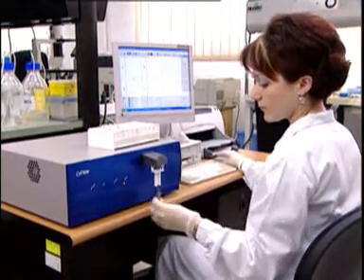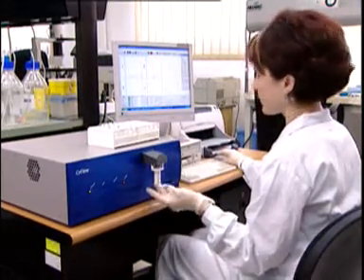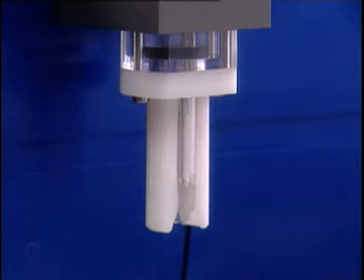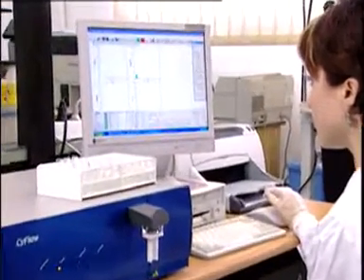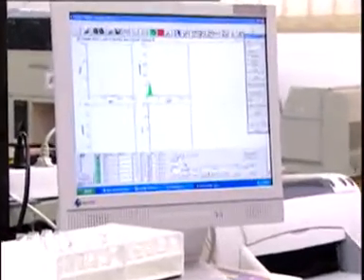As soon as tube C is analyzed, the software calculates the percentage of sperm cells that underwent the acrosome reaction as compared to the control tubes to give the final result and printout report.